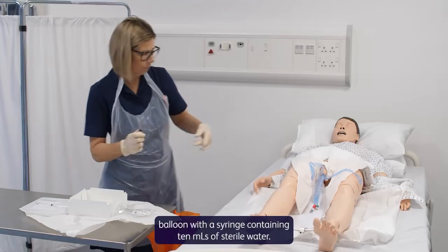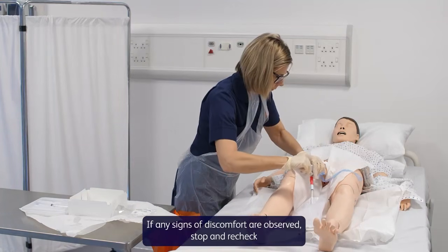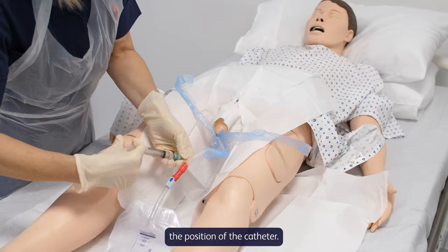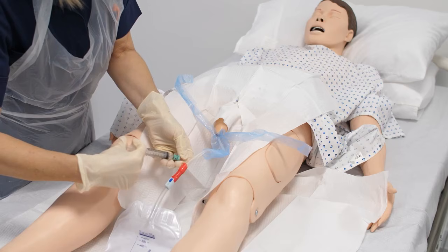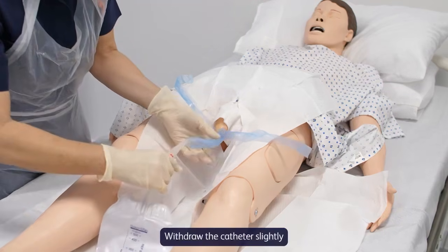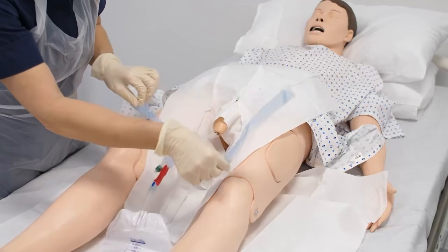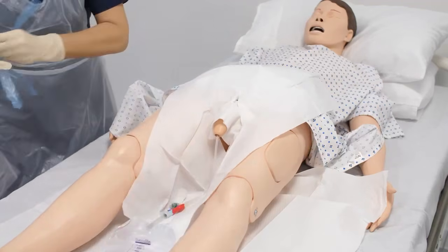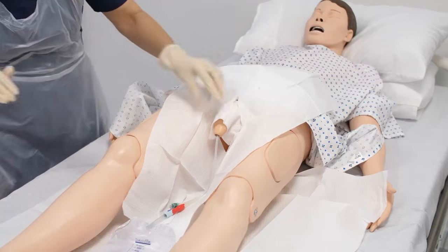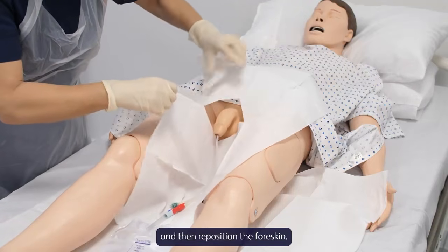Slowly inflate the balloon with the syringe containing 10 ml of sterile water. If any signs of discomfort are observed, stop and recheck the position of the catheter. Withdraw the catheter slightly until resistance is felt. Ensure that the glans penis is clean and then reposition the foreskin.